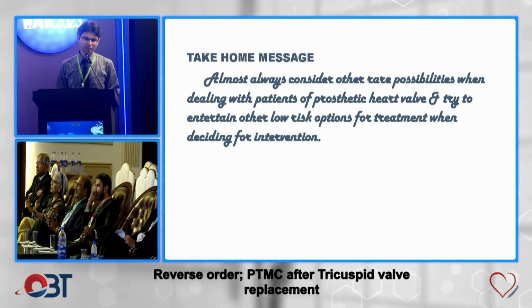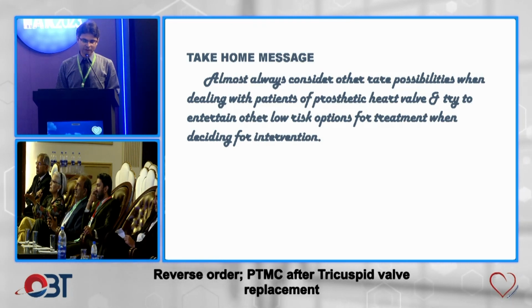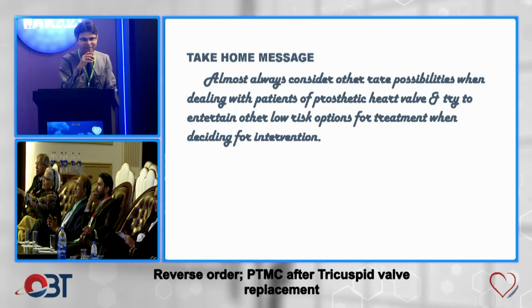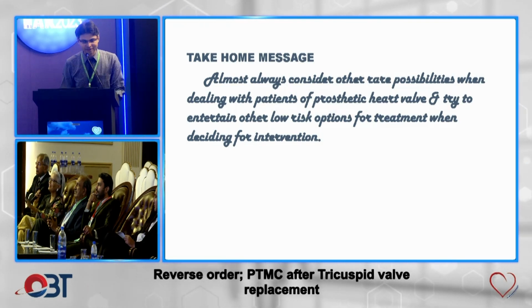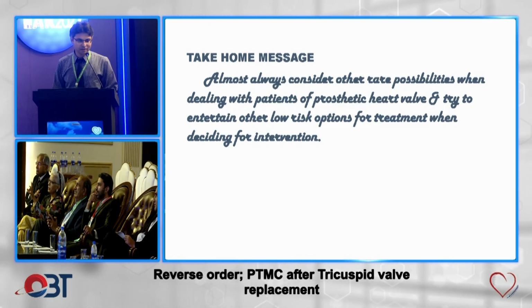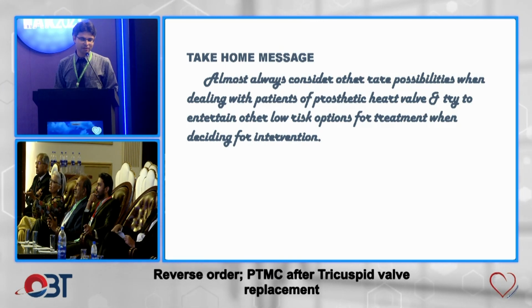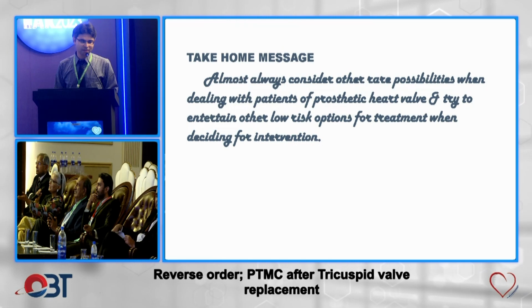आपने 97 में कहा है, probably NICVD में हुआ होगा. नहीं नहीं, probably NICVD में नहीं हुआ था. अच्छा, it was done somewhere else, okay, I can understand. At that time हमें ball and cage वालों से हम निकल चुके थे. I was just wondering why this patient had ball and cage. तो आपको क्या लगता है उसकी उस वक्त tricuspid की etiology क्या थी, tricuspid regurgitation की?